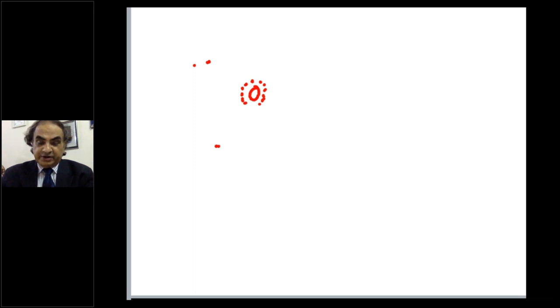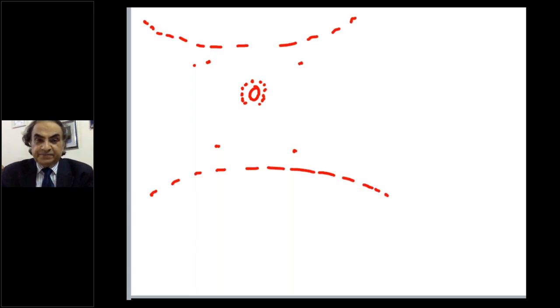If you're doing it in the upper quadrant, you put it either in the right hypochondrium or in the left hypochondrium. A lot of people prefer the left hypochondrium if you're going for some definitive surgery later on, such as duodenal ulcer perforation repair, so that they can use the same ports for the surgery later on. A lot of them like to use the left one because then you have the long stick, the freedom to work and act. So I hope I've made it clear.